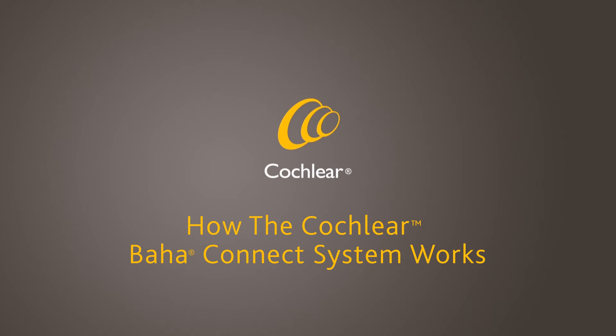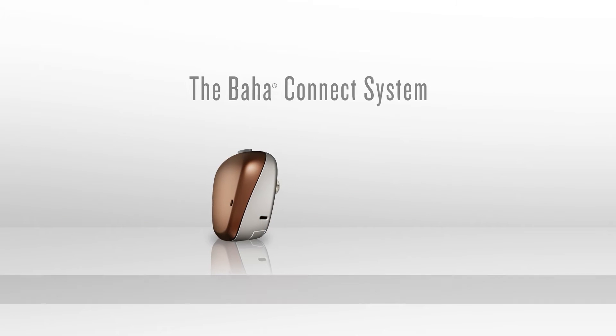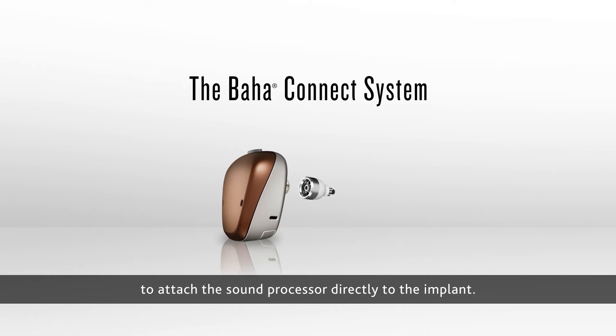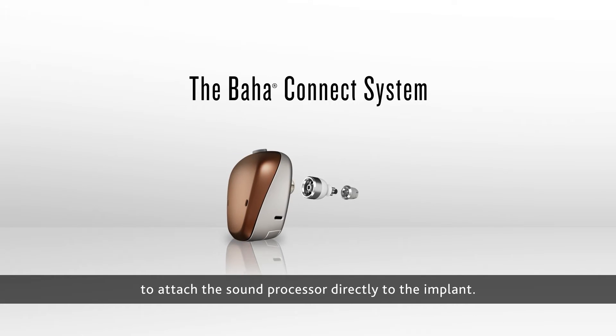How the Cochlear Baha Connect system works. The Baha Connect system uses a small abutment to attach the sound processor directly to the implant.